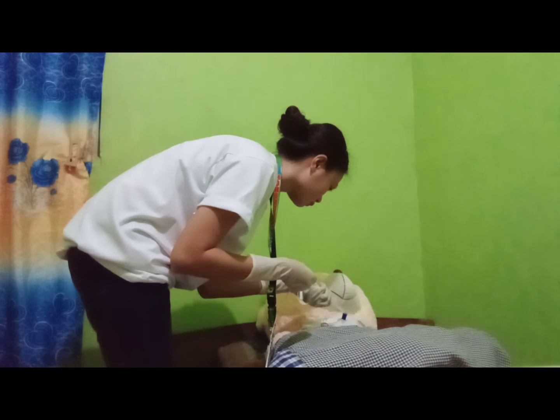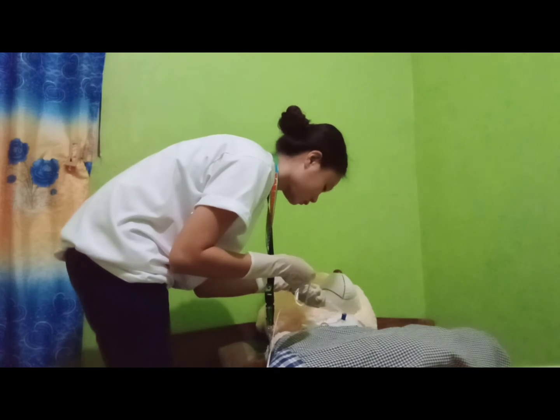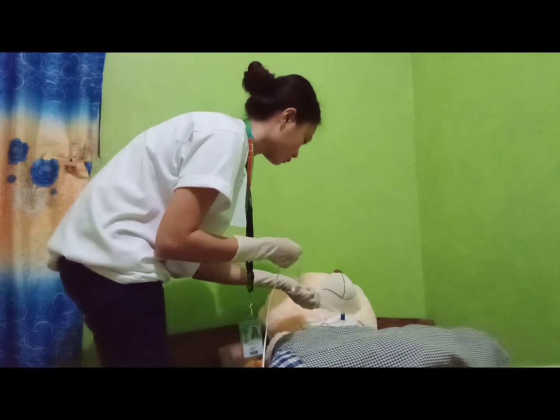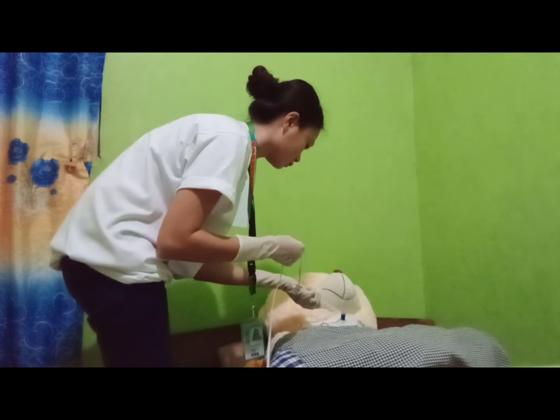Hyperoxygenate and hyperinflate using manual resuscitation bag for a full minute between subsequent suction passes. Encourage deep breathing. Rinse catheter and tubing by suctioning saline through. Repeat steps 10 to 14 until airway is clear, limiting each suctioning to 3 passes.